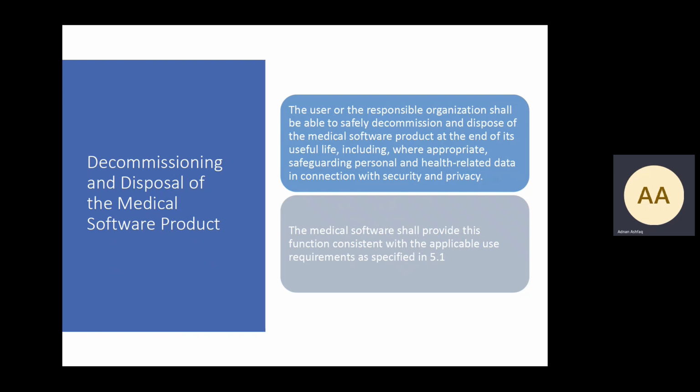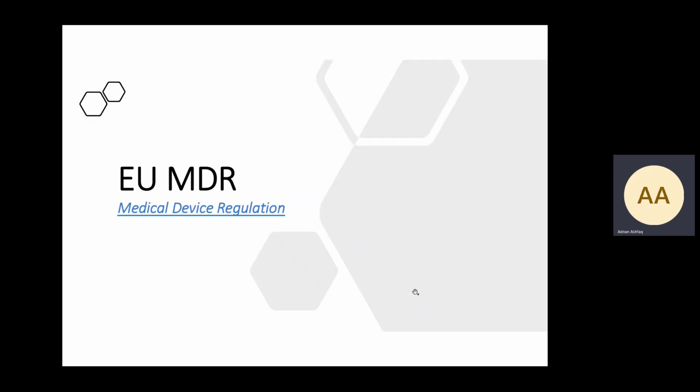The user or responsible organization shall be able to safely decommission and dispose of the medical software product at the end of its useful life, including, where appropriate, safeguarding personal and health-related data in connection with security and privacy. So this is probably where cybersecurity is also a very important element. And the medical device software shall provide the function consistent with applicable use requirements as specified in 5.1.